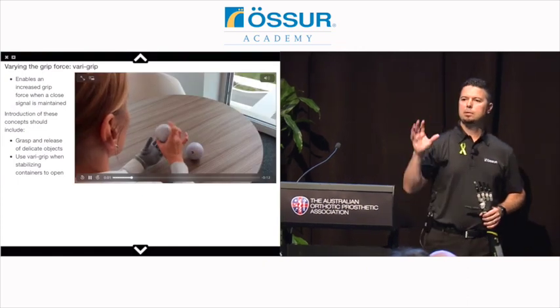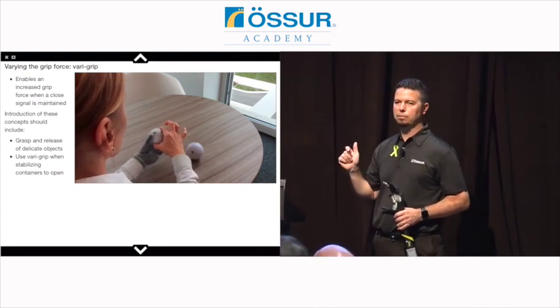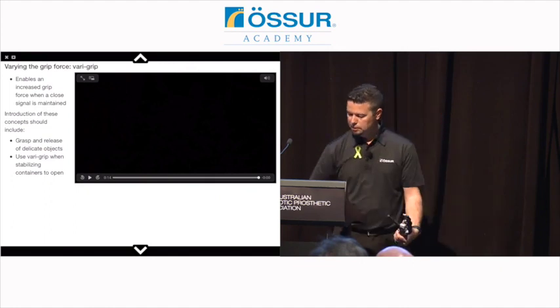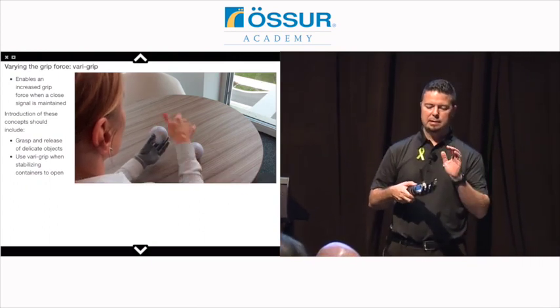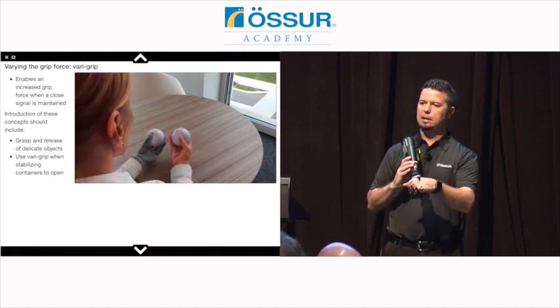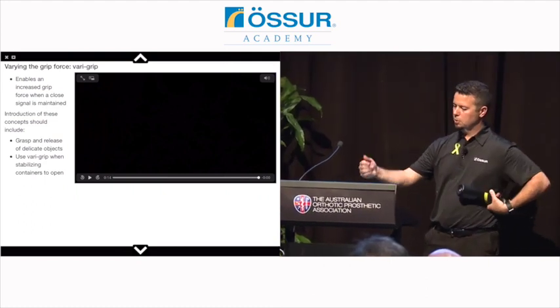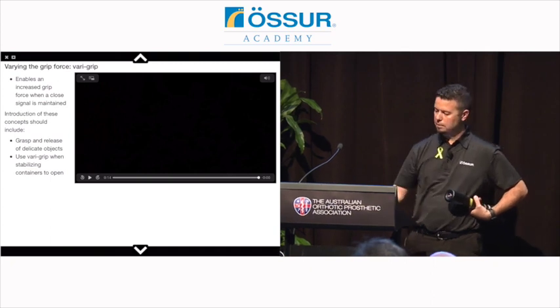All right, so that was those delicate objects, where you just want to lightly contract on something, but there are times where you need a little more oomph. And VariGrip is that extra oomph when you need extra grip force. Some of the things you want to talk about, in this video for instance, is how it's activated. VariGrip is activated by sustaining a close signal. So if they just simply close on an object, that's not going to activate that extra oomph. They have to sustain that close signal until you hear the VariGrip kick in. A way to demonstrate that is with one of those soft, squishy balls, or maybe a softer sponge, where they can see how VariGrip affects the force that they're applying.